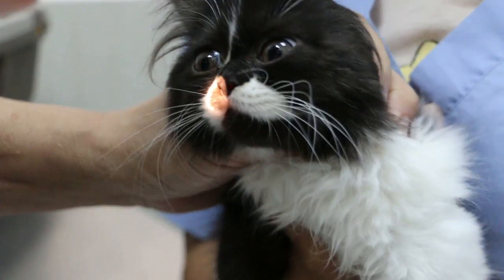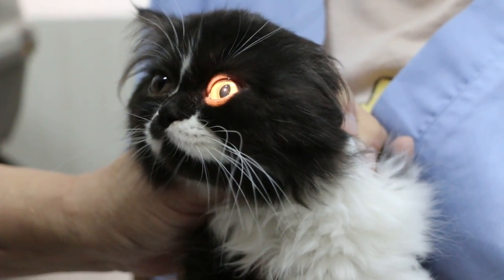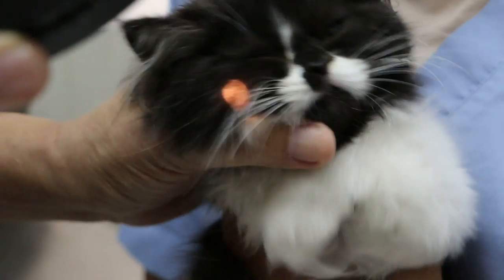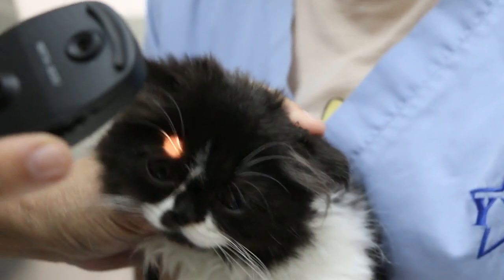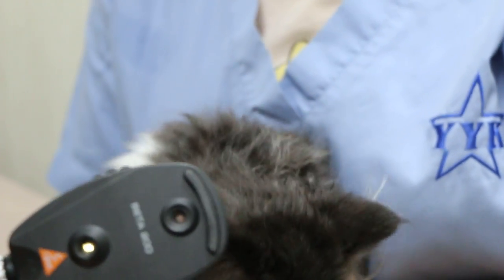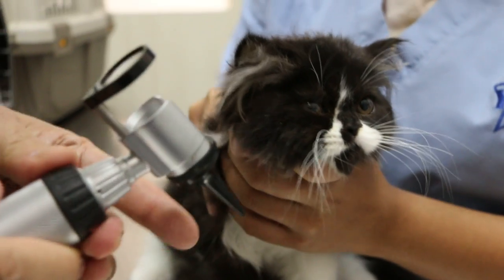It's okay, let me check inside. I'll go check for cataracts and any inflammation. So this is one of the usefulness of the ophthalmoscope. Of course the kitten may not like it. So this is the ophthalmoscope, shown here. Then the otoscope, we have to check for any ear mites or not.